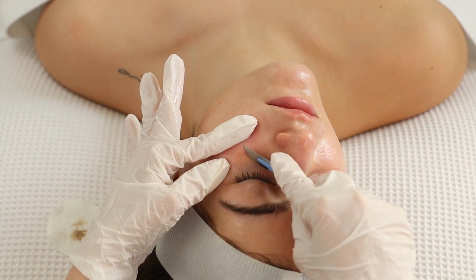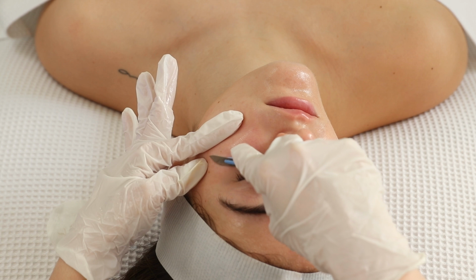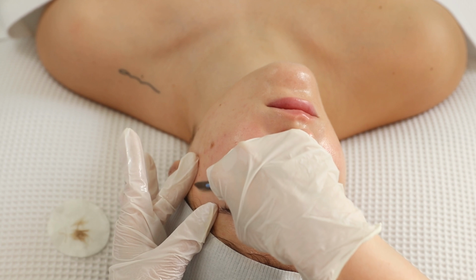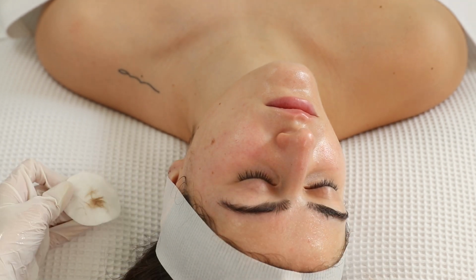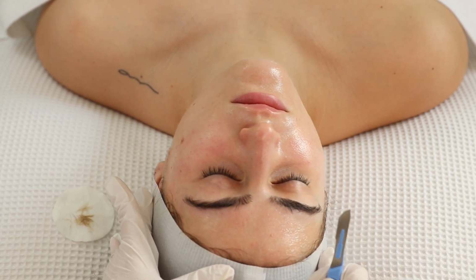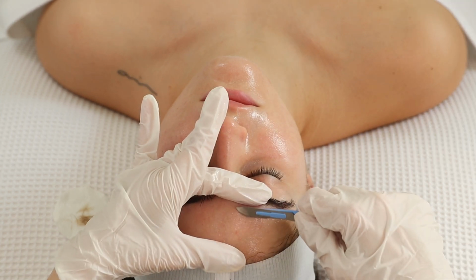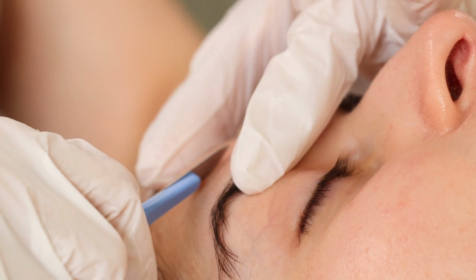While working around the eyes, be extra cautious and only gently glide with the blade. Once the cheeks are done, you can move on to the forehead. Gently stretch the skin and very carefully glide the blade as the skin here is thinner and you have a higher chance of grazing.